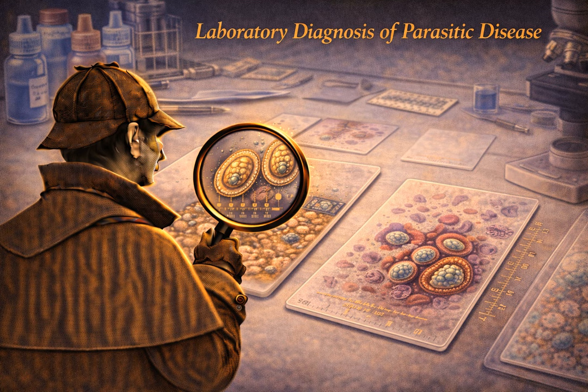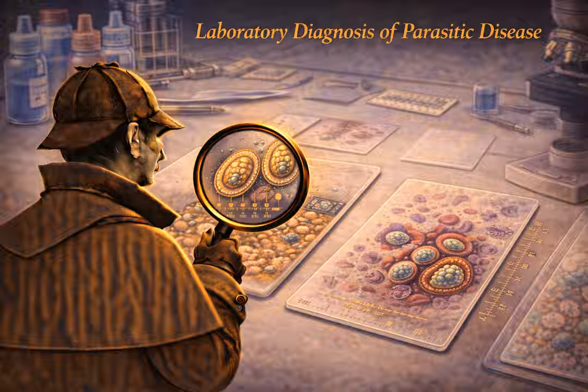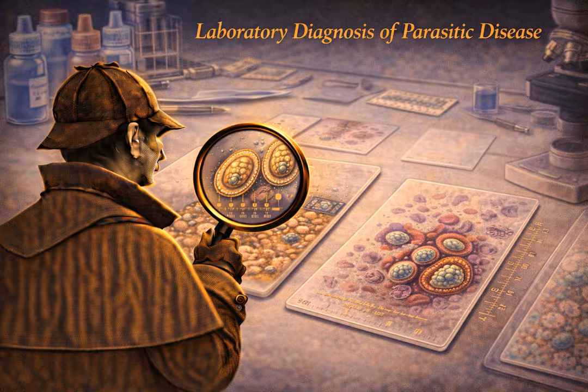If there is even one or two microscopic trypanosomes in that entire volume of sucked blood, the parasite will find itself in the bug's gut, its natural multiplying environment. It will rapidly replicate into millions. A few weeks later, the lab tech dissects the bug or squeezes out its feces and looks at that under the microscope. If the bug is now heavily positive, it proves the patient is positive. That is literally using the insect vector as a living test tube. That is absolutely wild. It is brilliant. It's rarely done clinically today now that we have high sensitivity PCR, but it perfectly illustrates the deep connection between diagnostic medicine and vector biology.